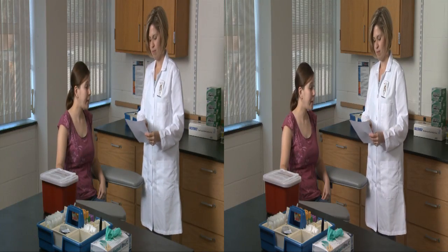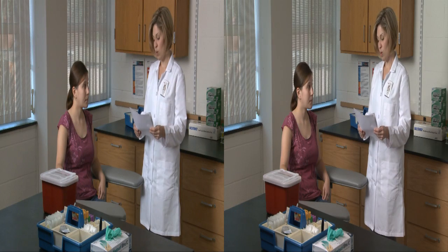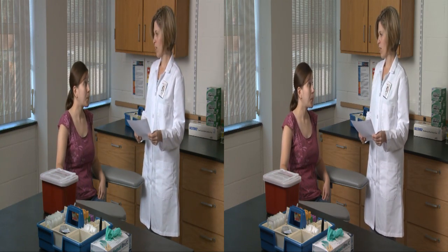Good morning. I'm Kristen. I'm here to draw your blood today. Good morning. Could you please state your name and date of birth? Pat White, November 11, 1986. Thank you. Have you had anything to eat or drink in the last 12 hours? Not since 9 last night. Thanks. Do you have any questions? No. All right. It will just take me a minute to get everything set.